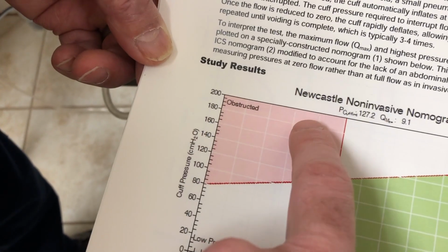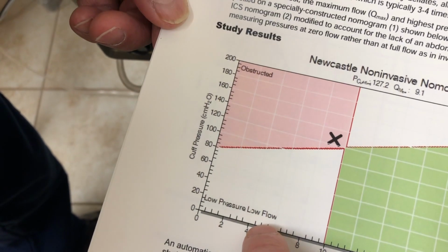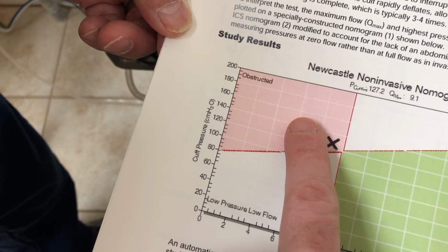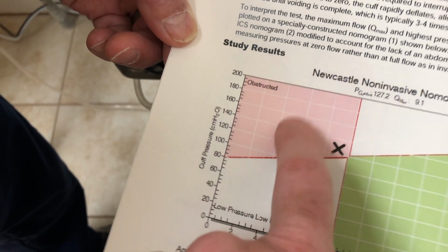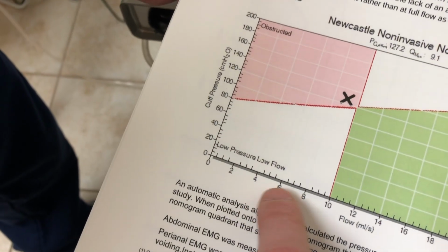So now we get high pressure and low flow. So that's when we start having a high post-void residual. The bladder still has some leftover urine in it, despite having generated a lot of pressure.